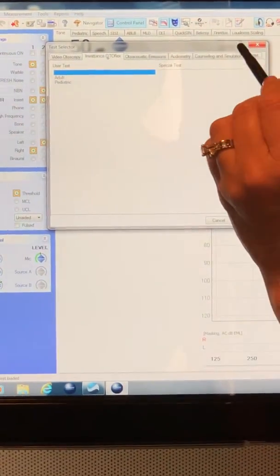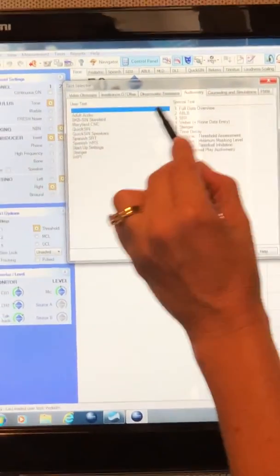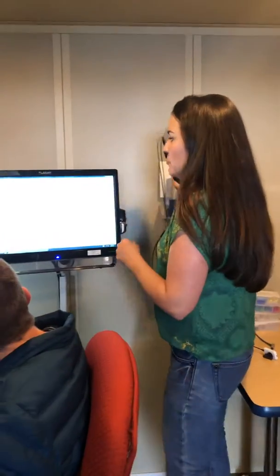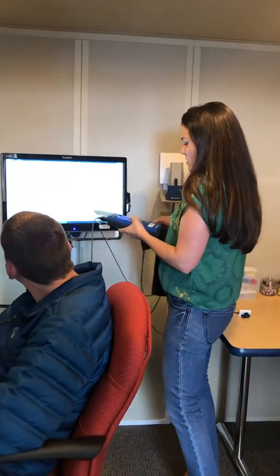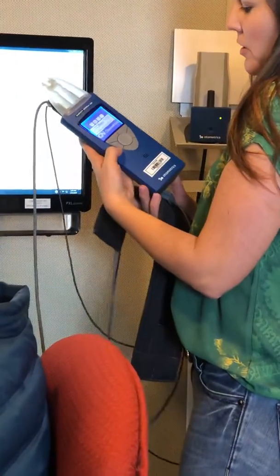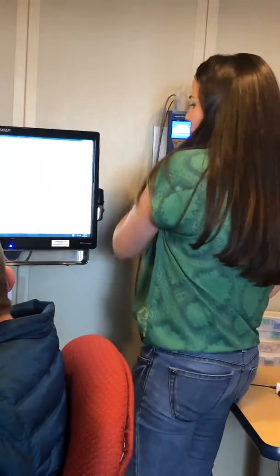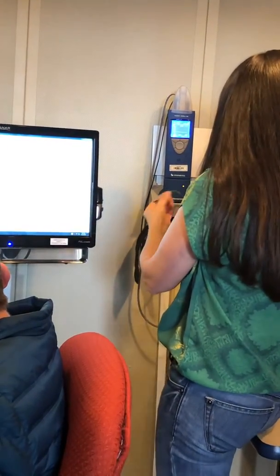I'm going to select otoflex. There's a specific protocol for pediatrics and one for adults — just a little bit of different settings, which is nice. The otoflex is actually connected via Bluetooth, so we can take it off the stand. Push power right here to turn it on. I'm going to wait just a second while it starts up.